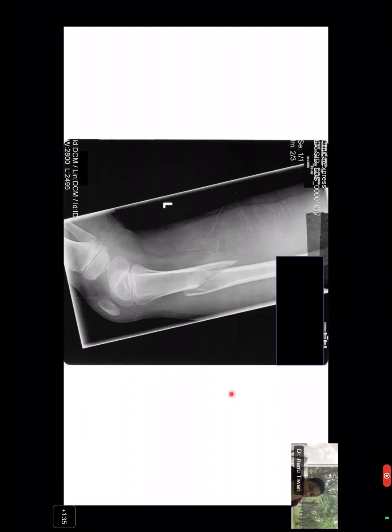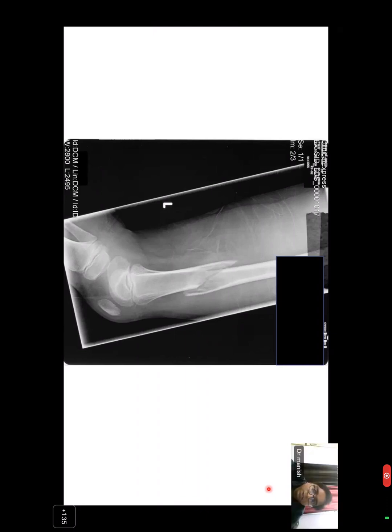Give this bone radiology a shot. Hello, am I audible, sir? Very much, yes. Go ahead. Sir, I was given a 34 female tibial lesion, but it looks like... Ignore that history. It's a much younger patient, and it's in the femur. Sir, there is a fracture there, which includes the cortex as well as the medullary part of the bone.